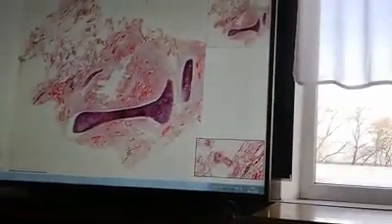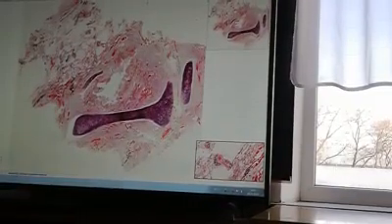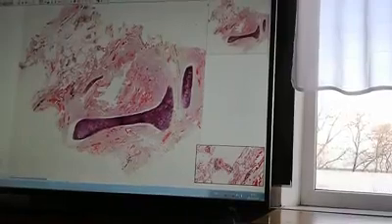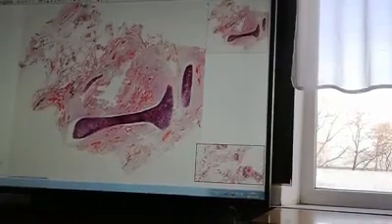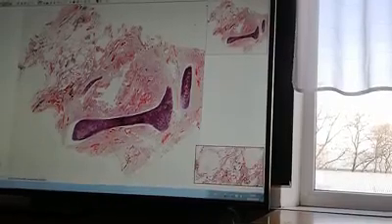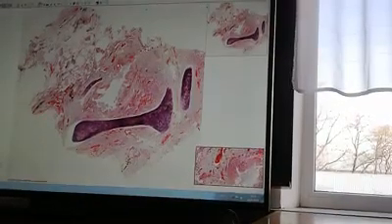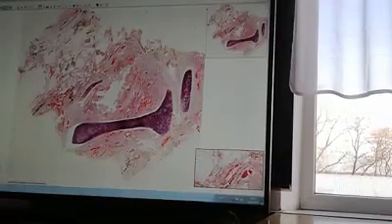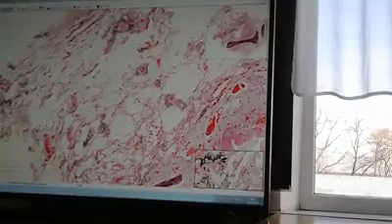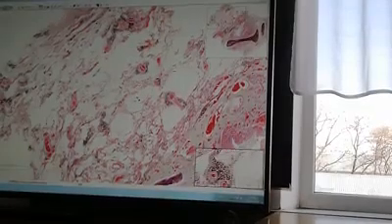You know that bronchitis is an inflammatory disease of the bronchi, and the chronic variant, compared to acute, is accompanied by a majority of different pathological processes. Mostly these processes are compensation and adaptation processes. So let's see. It's a fragment of lung tissue stained with hematoxylin and eosin. In the upper part we can see alveoli filled with air, and black color accumulation. These are dust particles, but without clinical significance, so it's not important.